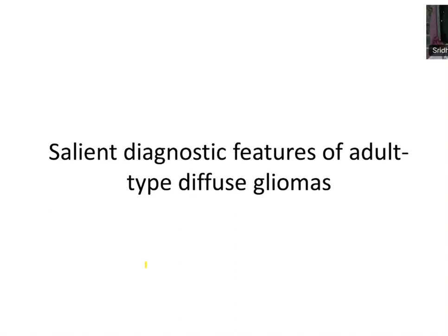What will happen in tumor? In an IDH mutant tumor, what will happen to the normal IDH1 protein? More likely to be negative. So in choosing an appropriate antibody, you have to choose IDH1 R132H. If you don't specify the type of antibody you're asking for, you may land in trouble. If you are interpreting something as reactive gliosis and your mutant specific antibody is positive, it cannot be called reactive gliosis. That question has been answered. Reactive gliosis will never be positive for IDH1 R132H.